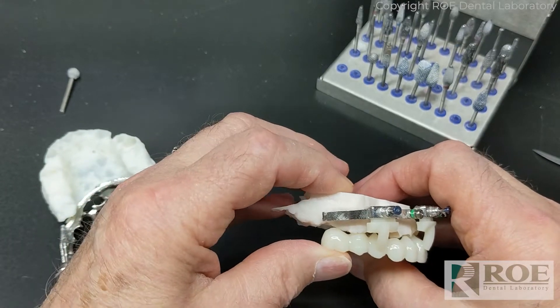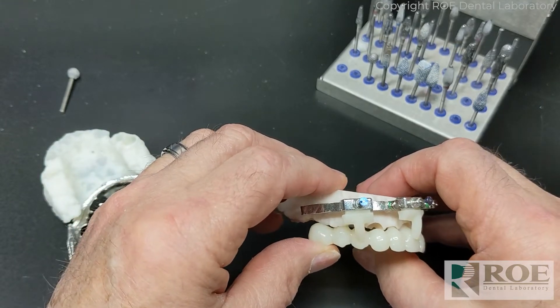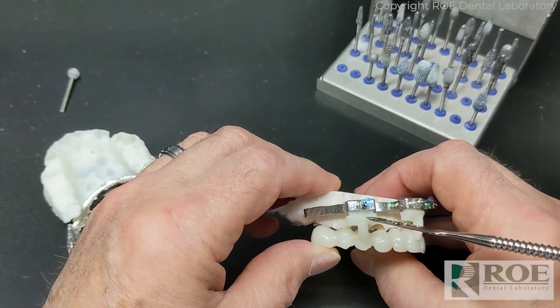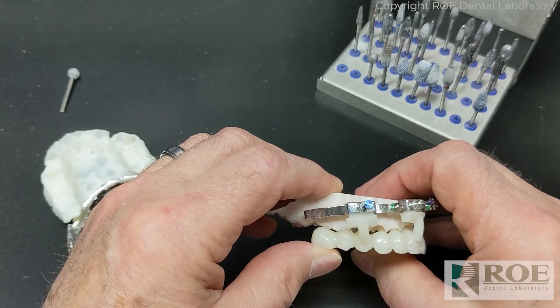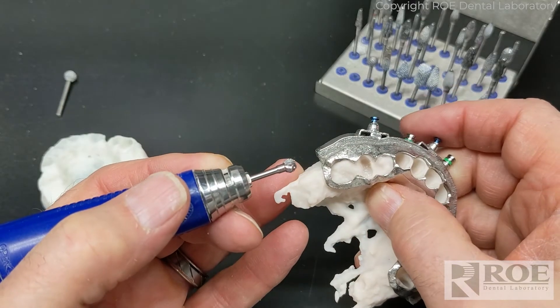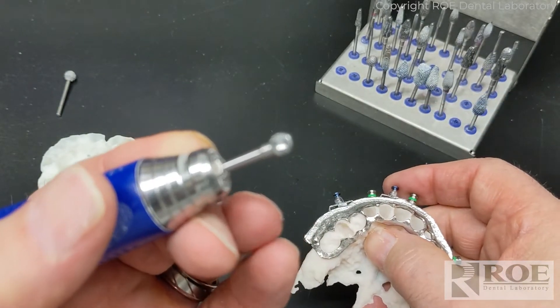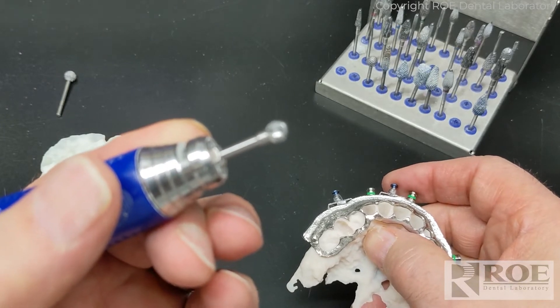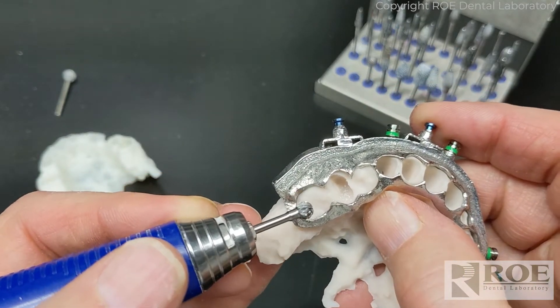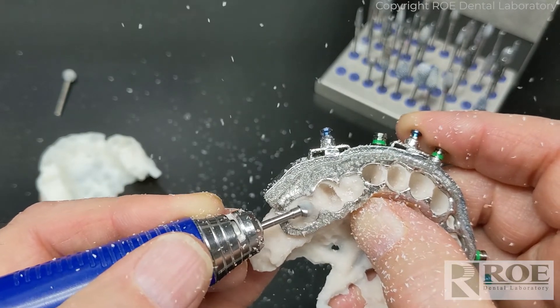Right away on this case I see that in this area on the molar that's a pontic section, so I'm going to have to make an ovate pontic down to about a millimeter or two. At that point if it still doesn't go down, I'm going to relieve the intaglio side of the pontic itself. The next step is we put the scallop guide in place on the fixation base and use a round burr — we call it a BB burr, it's almost a quarter of an inch in diameter — to relieve the pontic section on the bone to create an ovate area for the pontic to sit.